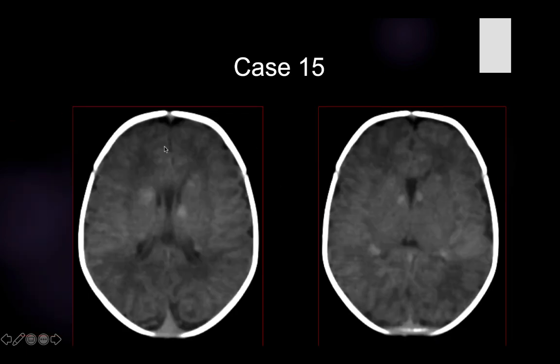And here in the final case, we can see in this CT scan of the brain of a child, there is a hyperdense nodule along the subependymal location, which is a typical example for tuberous sclerosis. We mentioned tuberous sclerosis in previous cases frequently, but this is an example for the CT appearance, and we can see here this nodule, which differs from the cortex. So this is not a subependymal gray matter heterotopia. Its appearance is not similar to the gray matter, it is more hyperdense, so it is more in keeping with tuberous sclerosis, and this is an example for tuberous sclerosis.